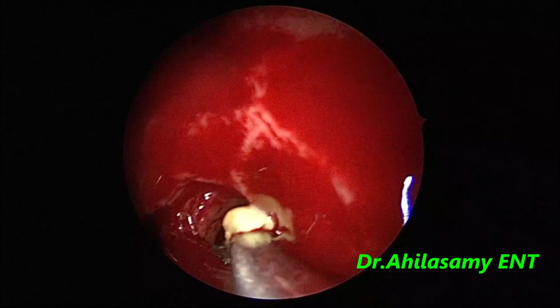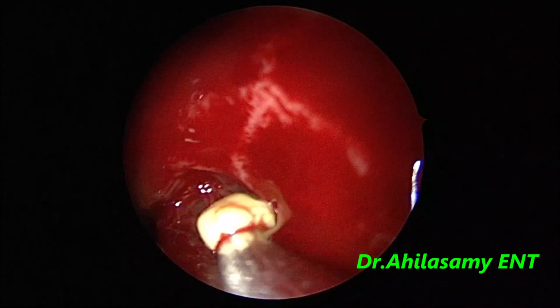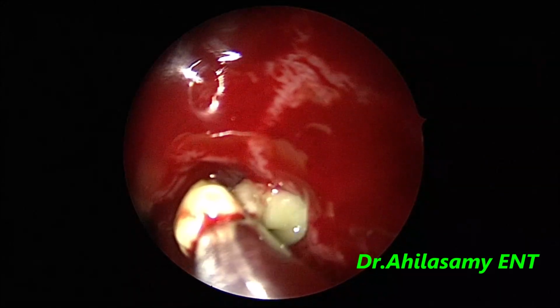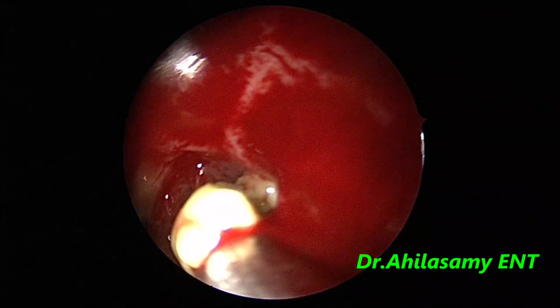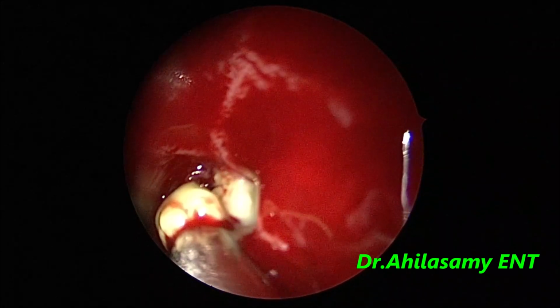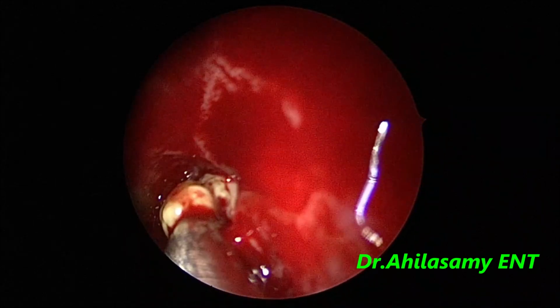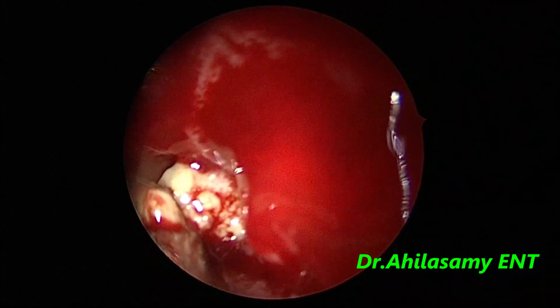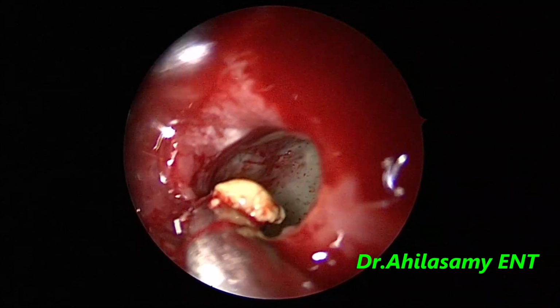Again, the fungal material which is semi-solid or butter-like is being sucked out. Cheesy, you can call it. So always, if you know that it is a fungal case, use itraconazole and prednisolone preoperatively for 5 days to 2 weeks. It makes your job easy.